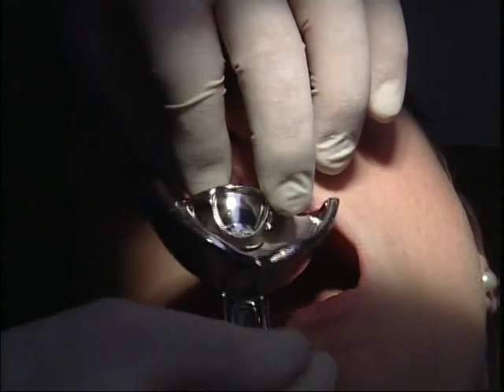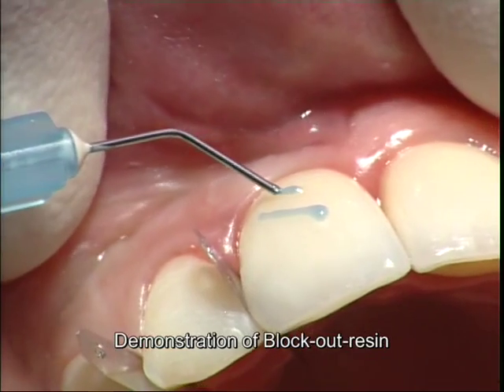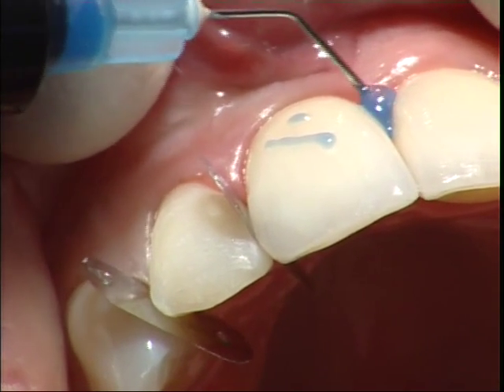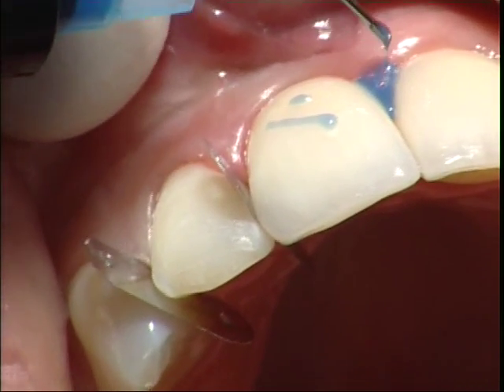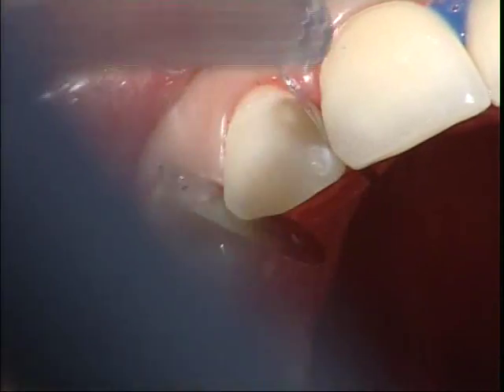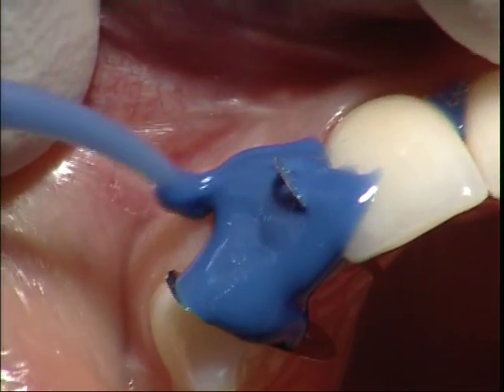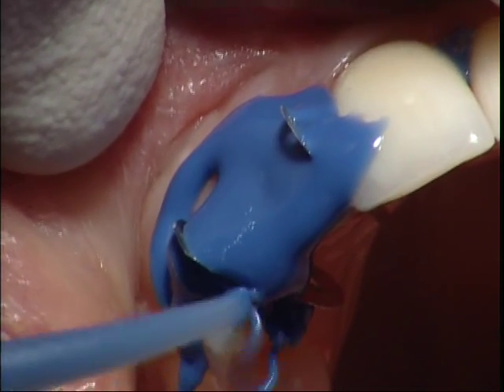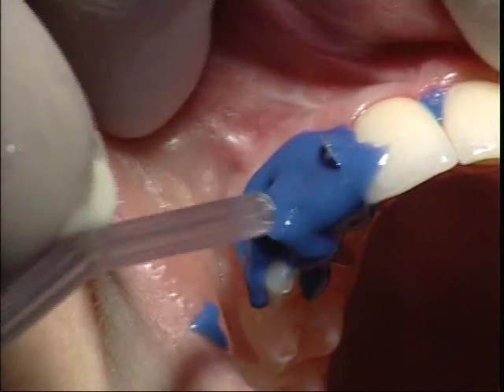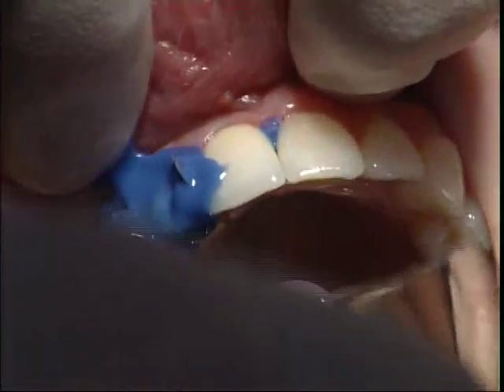This is just to show you how thin I can run the block-out resin, which I will use here to block out some undercut areas. Because some undercut areas, especially if you have open embrasures, will prevent me from taking out the impression easily. Block-out resin — Ultradense block-out resin. Here comes the Permadyne, the Impregram syringe material. After that comes the tray with the tray material. I am blowing the Permadyne to guarantee it is in place. And now this should polymerize for five to six minutes.